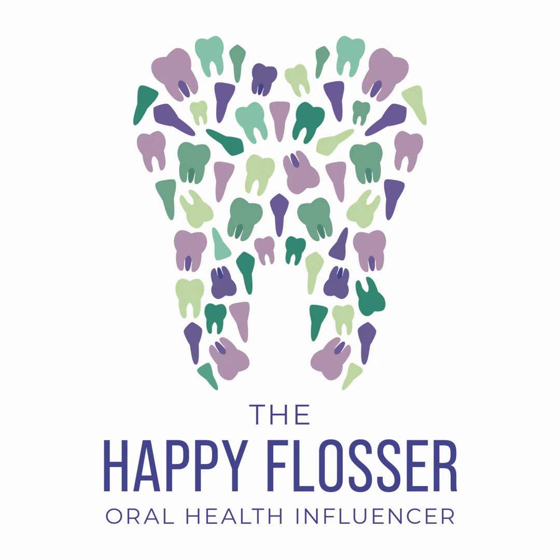No cone cuts, no overlaps, no motion of your patient, correct angulation, proper density and contrast, complete coverage of all the areas of interest, aligning with all the rules that you had to learn in radiology to get a diagnostic set of quality images. That's really the foundation that starts you off on the right foot to doing proper interpretation of radiographs.